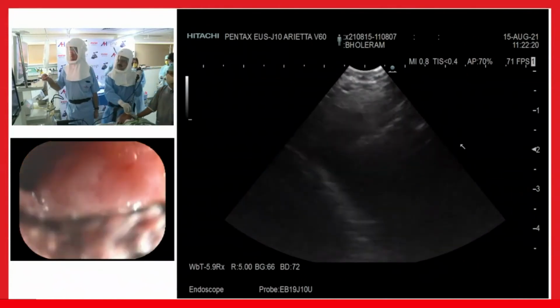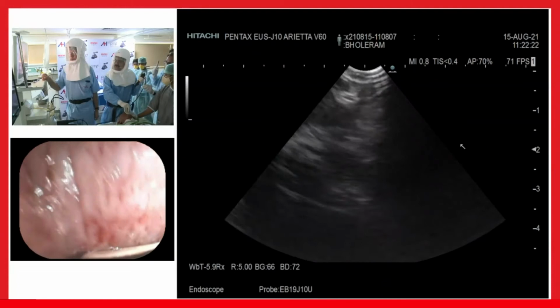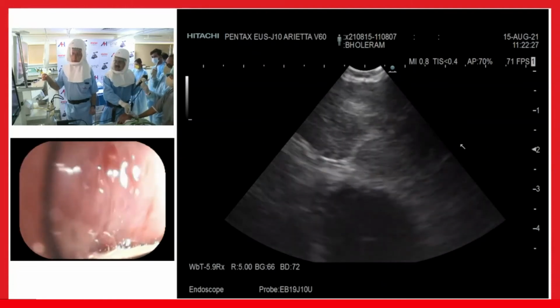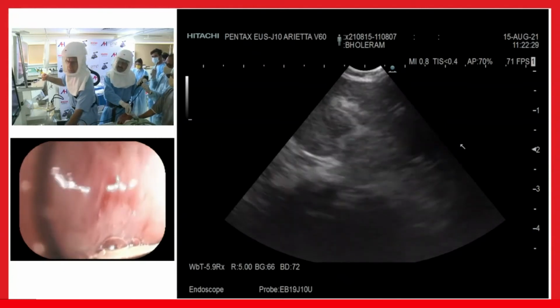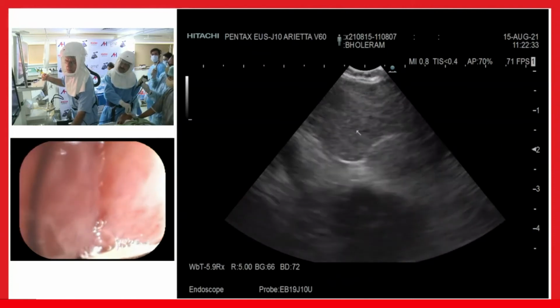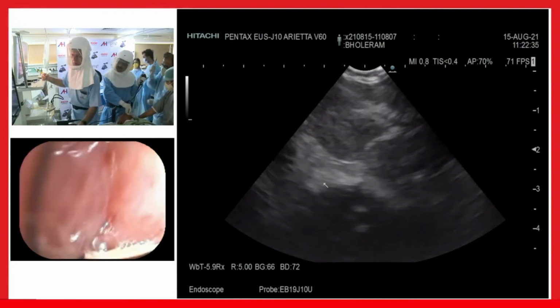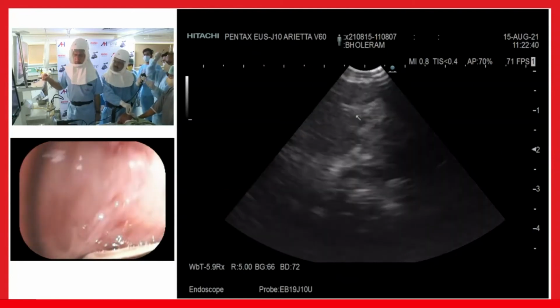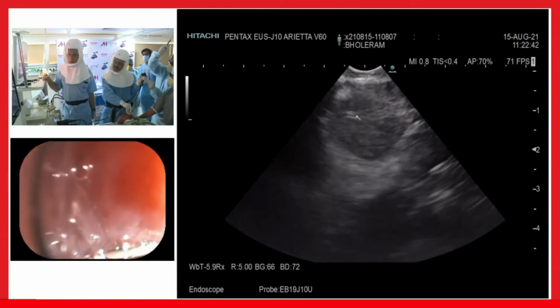Now from the right side, you can see the subcarinal area. Again you can see here, you can visualize this lymph node, the large station 7 lymph node. This is the large subcarinal lymph node seen from the subcarinal area. So you can see the subcarinal node from both the right and left bronchus.